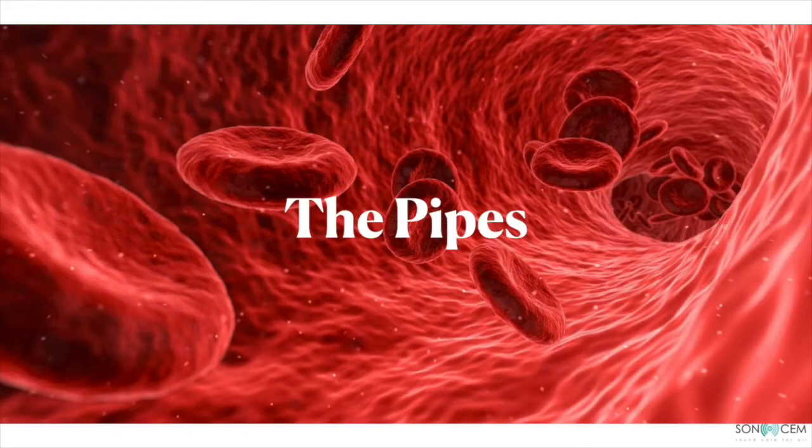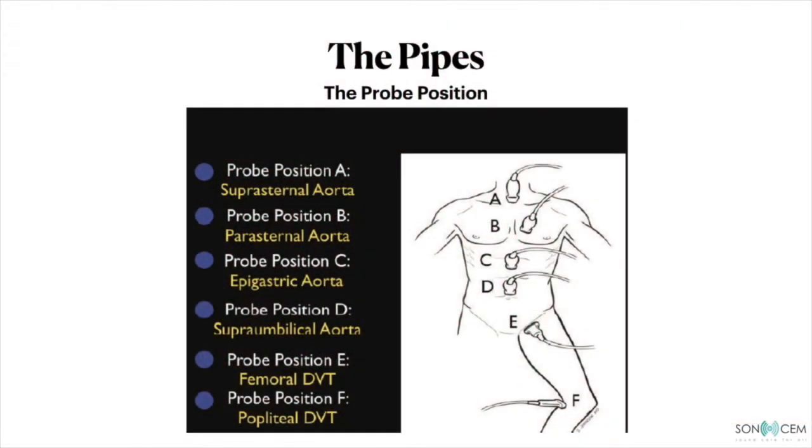Now we have finished assessing the tank. We move to the next assessment, which is the pipe system. Here we will scan the aorta from its root extending to the arch, then the abdomen until it bifurcates into the common right and also left iliac arteries, looking for any leakage of the pipe.